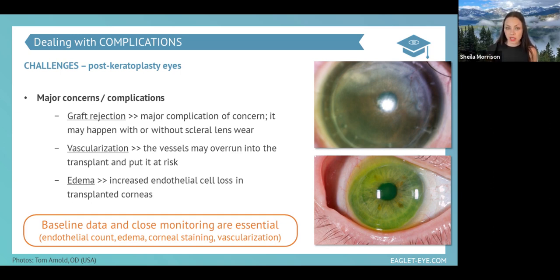We check for edema, usually whenever possible, by measuring a baseline corneal thickness prior. This can be done with a variety of instruments, but having that baseline, sometimes, if you do an evaluation on a patient, fit them and forget, it's kind of hard down the road to be looking for a very subtle edema. Of course, there are clinical signs that we see, we'll see endothelial folds.